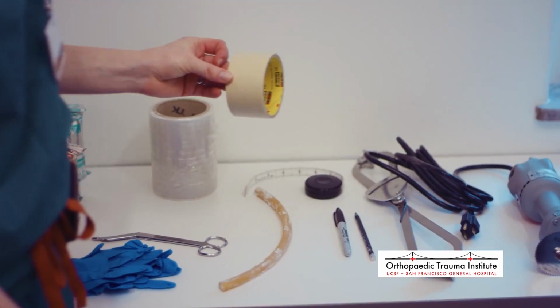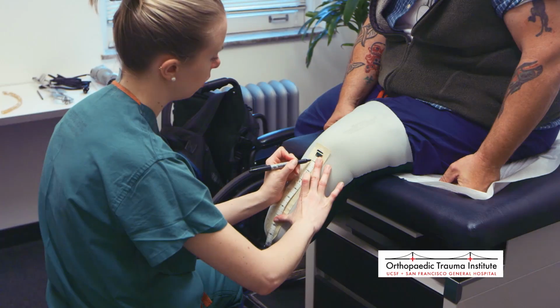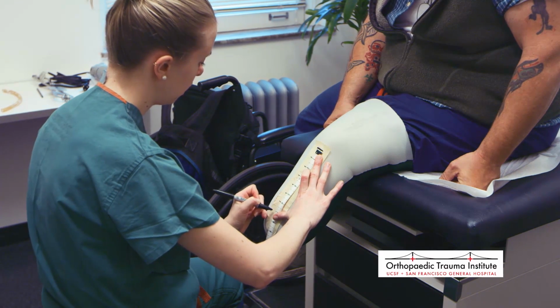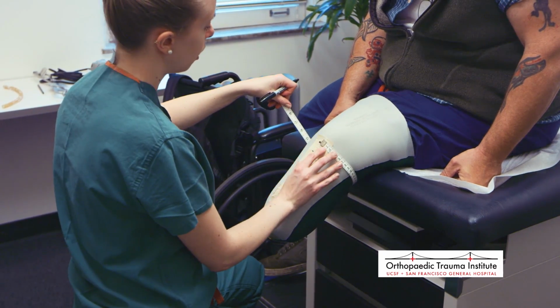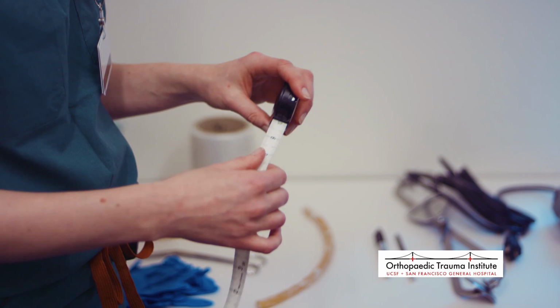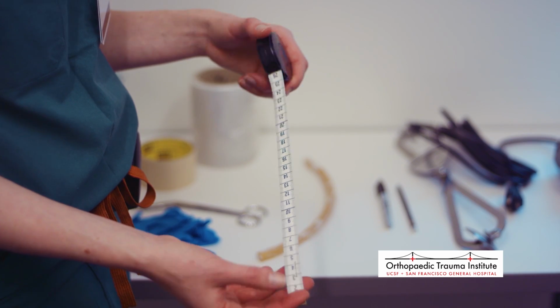I'll use tape to mark out length on the residual limb, just regular masking tape to help me keep my inch increments. I use a tape measure to take circumference measurements around the residual limb. Also for length of the foot and the knee to the ground and those other anatomical measurements we use a tape measure for, usually in centimeters.